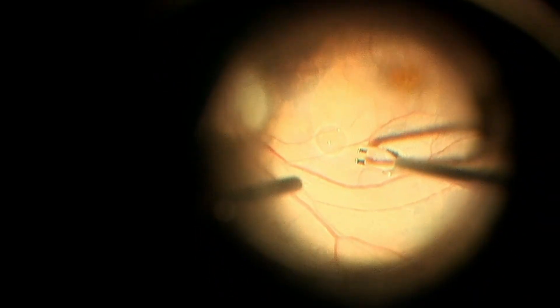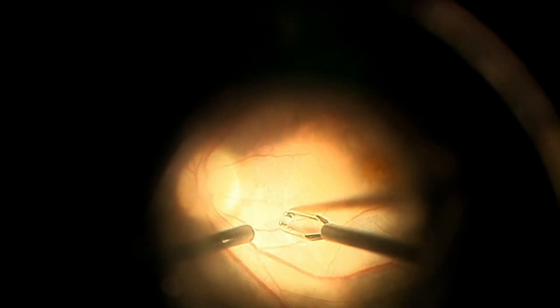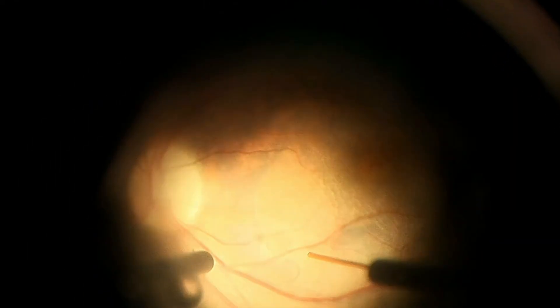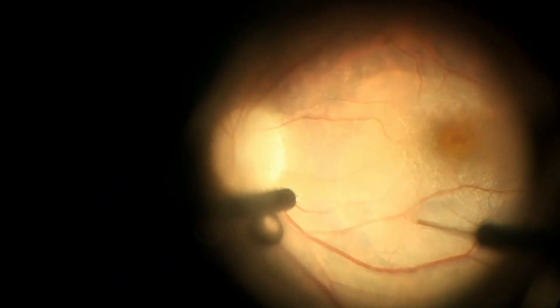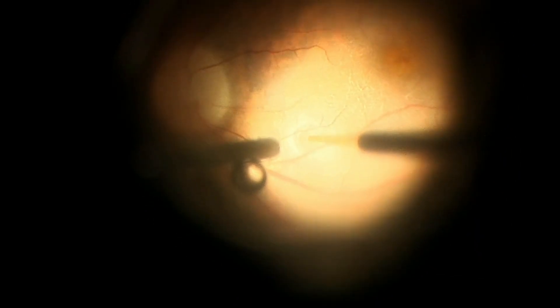The other nice thing here is it's a fairly large, easy-to-see bubble. When I've done this case — I think I showed one of my cases on Retina Rounds earlier — what I like to do is have a soft tip cannula, either a backflush cannula or just a regular soft tip not attached to the machine. I'll put the pressure up a little bit, maybe from 25 to 30 or 35 mmHg, then touch down after peeling the ILM — just touch down right over the bubble using passive extrusion, and the bubble just comes right through the retina. It's kind of incredible. The surgeons here are actually using a subretinal cannula, piercing the retina, getting into the subretinal space, and actively aspirating.